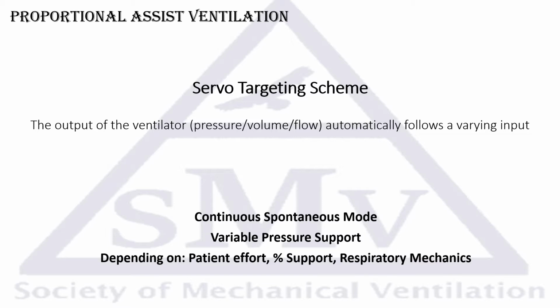The pressure support or the driving pressure delivered by the ventilator will vary, and it will depend mainly on the patient effort, the percent support dialed by the clinician, and the respiratory mechanics.